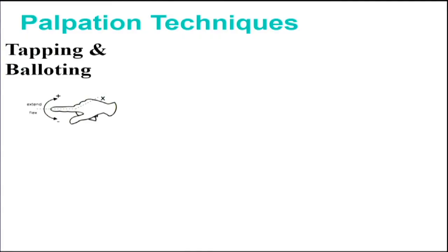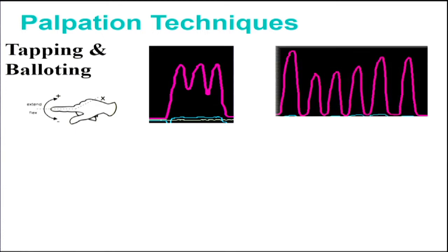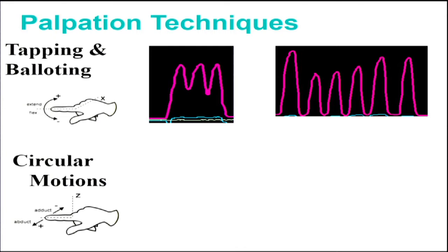We started to notice, I had a data mining professor at Stanford say, well, why don't you do an experiment where you do movements that you normally do, and just focus on that movement and see if we can see some patterns. And that was actually eye-opening for me, because this is what it looks like if you're pressing in one place up and down, and this is what it looks like if you're pressing up and down in a small circumference. And you can see the pressure goes down to 0 when you lift your finger all the way away from the tissues that you're pressing.